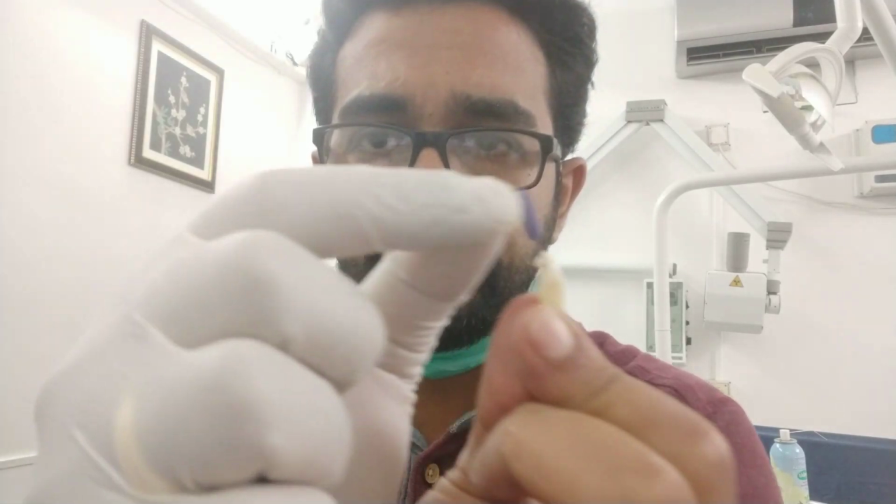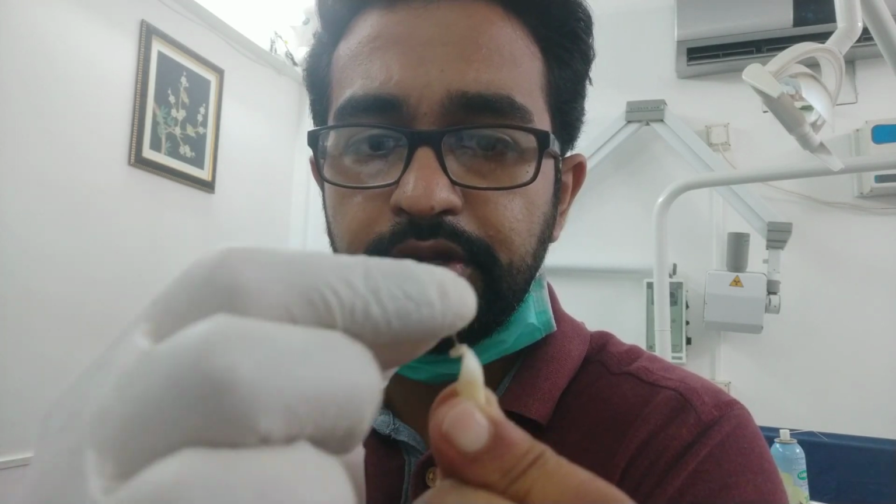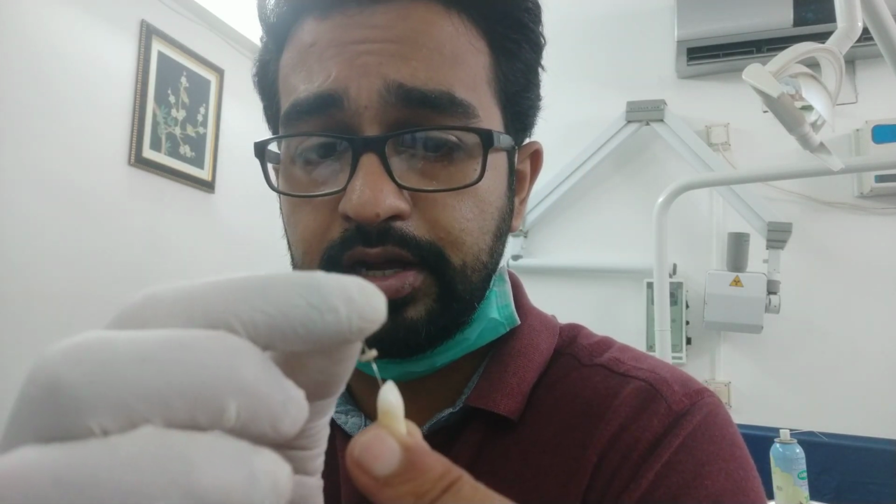So again इसको फिर मैंने irrigate, इसको मैंने filing किया number 8. So you see the canal is getting larger every time, right? So you have to prepare with this K file. All these K files are coming from the Dentsply company. So this is all 2%. 2% means the thickness is very less, it's very thin, right? So you can even do it with a ProTaper after filing with number 20 file.